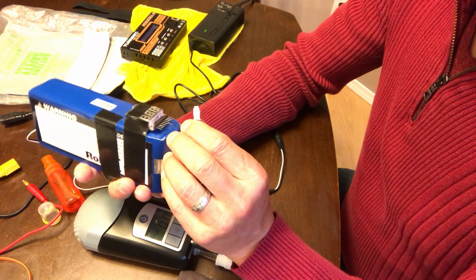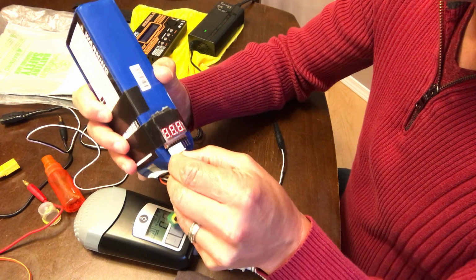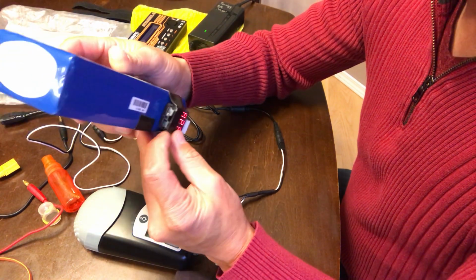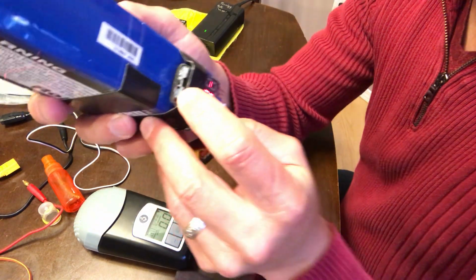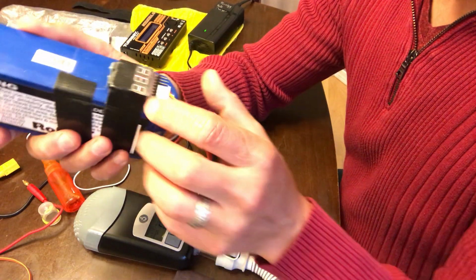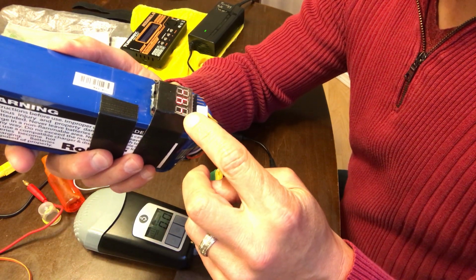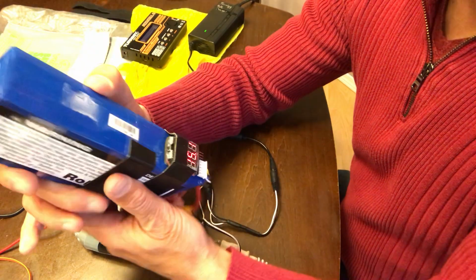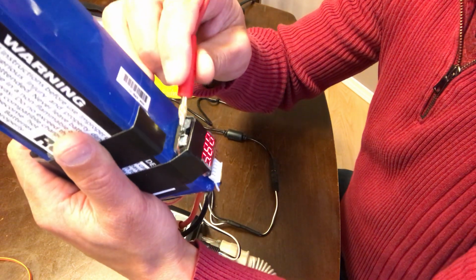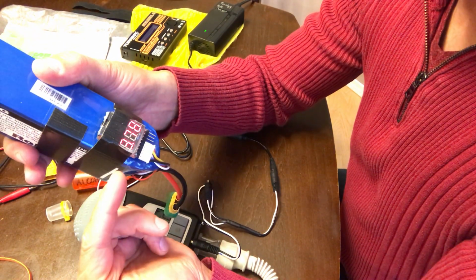So when I know I'm actually getting low, I will use this device. What this does, it also does the same readout, tells me the voltage and everything, but it has 2 little horns here. You can see that I've actually filled those with a little bit of hot glue because they were so loud. The intention here is this is a device that will alarm when the voltage goes too low. So if your battery pack goes below 3.3, for example, it can be set. You can set it to whatever voltage you want to. There's a little button right there in the middle there. You can set it to 3.3, 3.2, 3.1, whatever. I've got it set to 3.3 just to be safe.